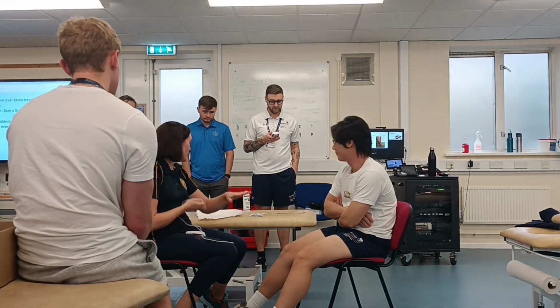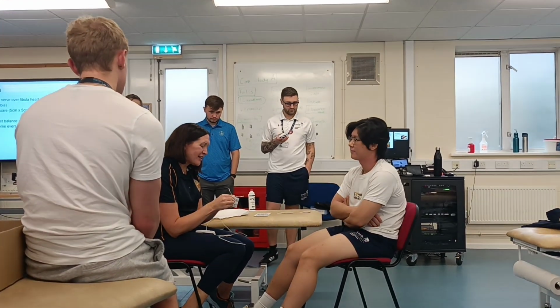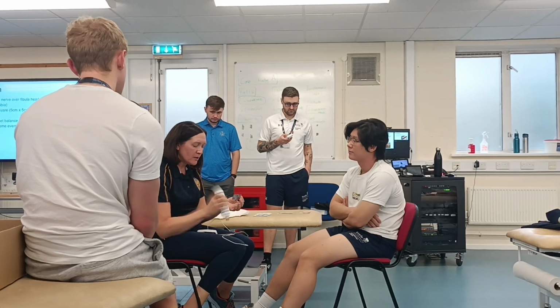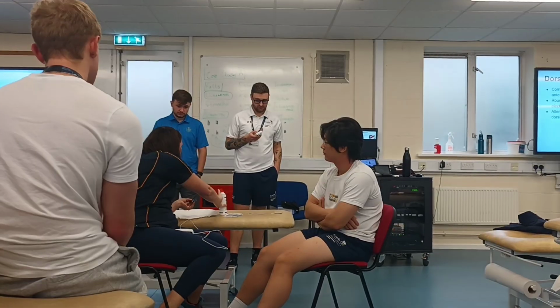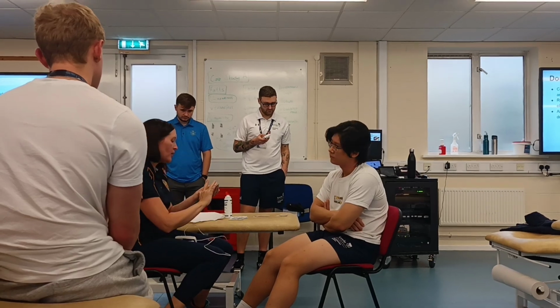Okay, I've checked my patient's contraindications. I'm happy that I can use electrical stimulation. I'm just going to put a little bit of gel onto the electrodes just to help it go through the skin. So just like a pea-sized amount. I'll put that there for the other electrode. Okay, so rub it all over the electrode.